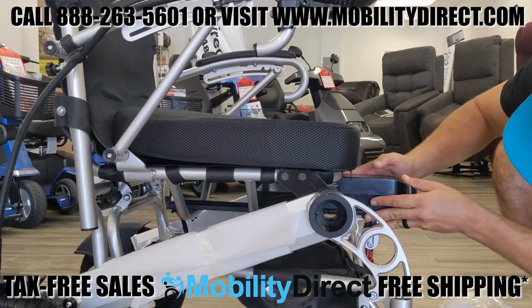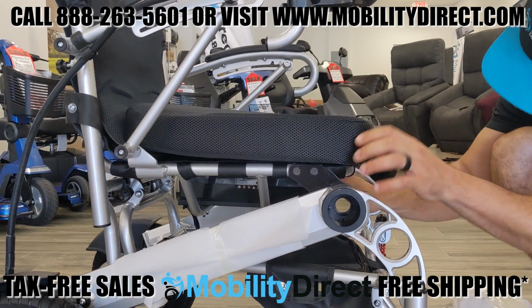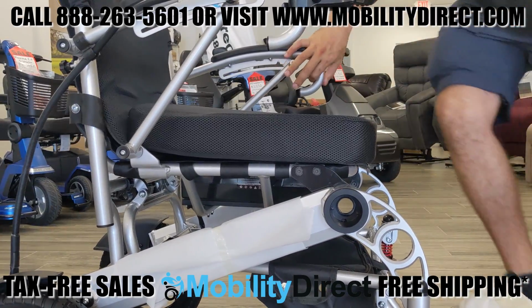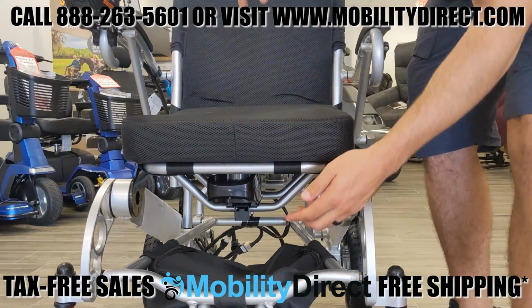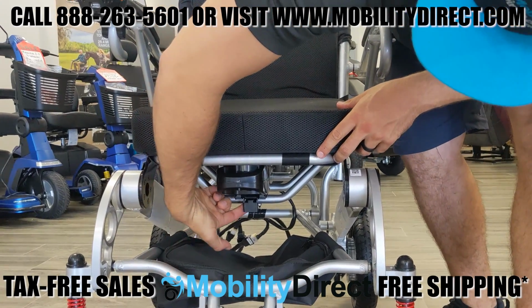So that clip, it's hard to see from this angle, but we're actually pulling it so that it can secure itself into the harness. And when you want to remove it, same thing. You've got to use that clip to pull it out. As you can see, we're demonstrating how to remove it. You just pull on the clip and then slide back.